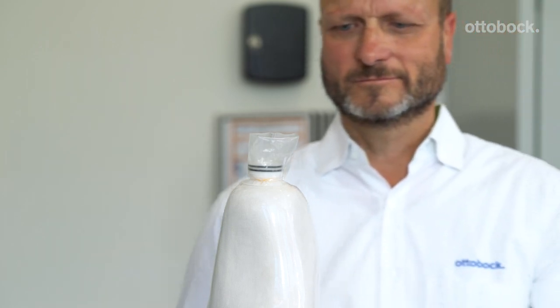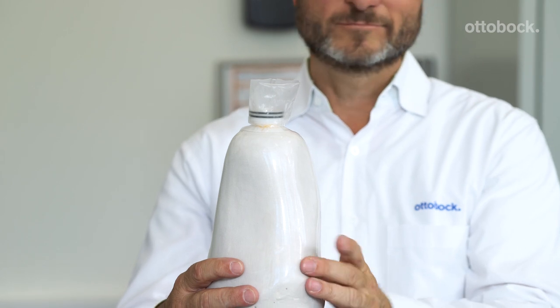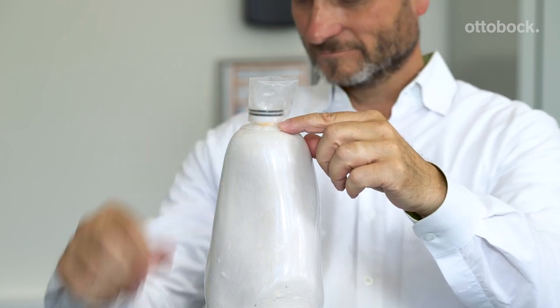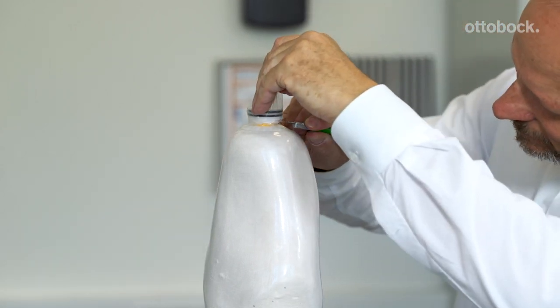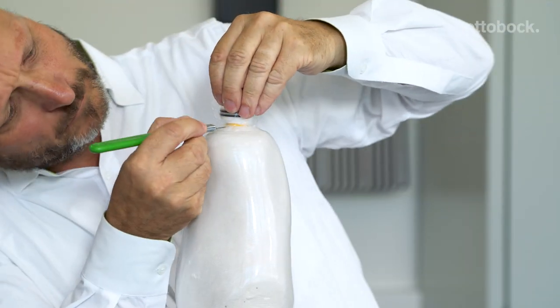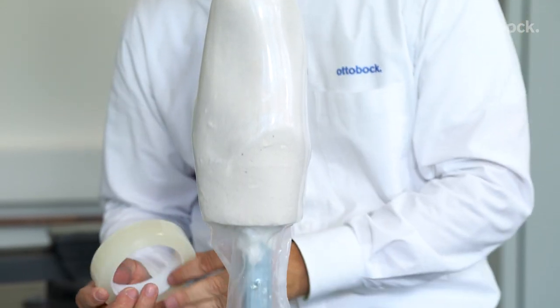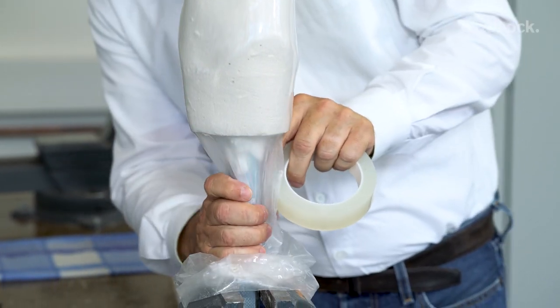We've prepared a PVA bag and stretch it over the plaster model. Using thread, tie the PVA bag off in the narrow portion of the piston dummy as shown here. Using a scalpel, cut away any excess PVA bag just above the thread. Fix the PVA bag distally and secure the seal by cutting away excess PVA and taping it in place around the vacuum tube.